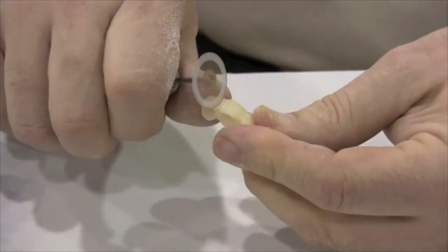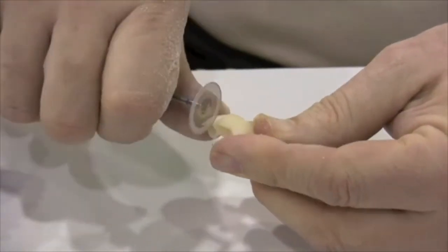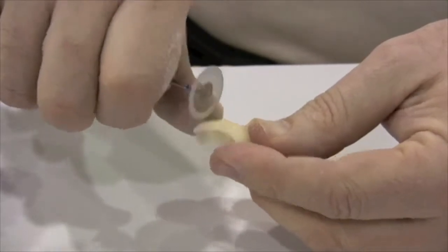I'm going to simulate facial embrasures here a little bit, opening up the gingival embrasure on the facial aspect.